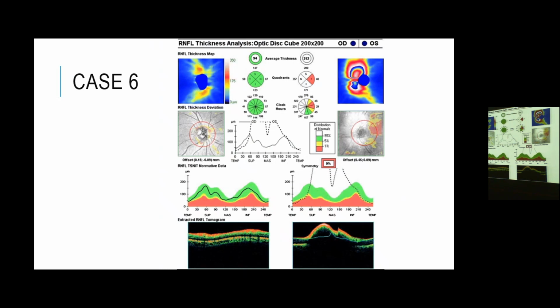So, last case, who wants to take this? So let me ask you, what do you think? What is going on with the left side here? Yes. Who answered? You? Sorry for interrupting. Yeah, so myelinated nerve fiber layer.